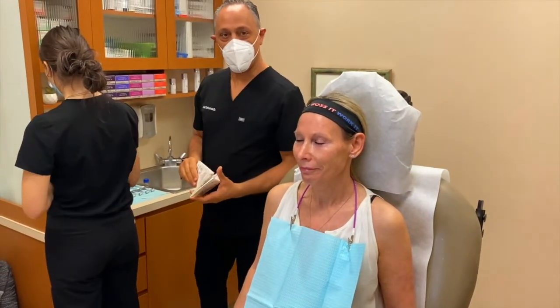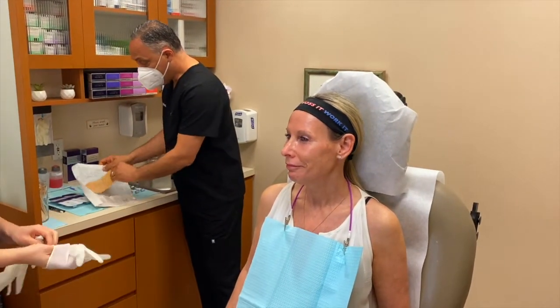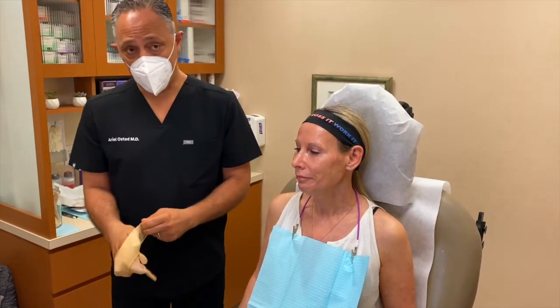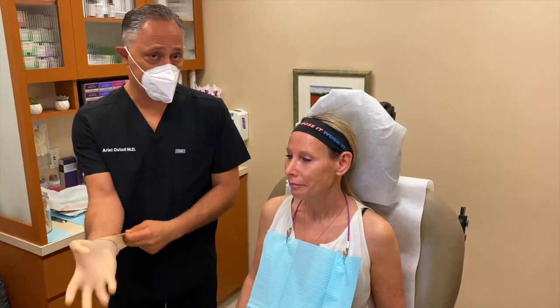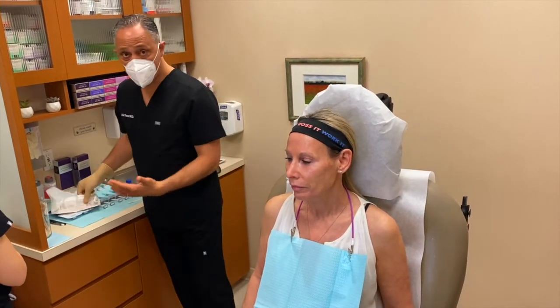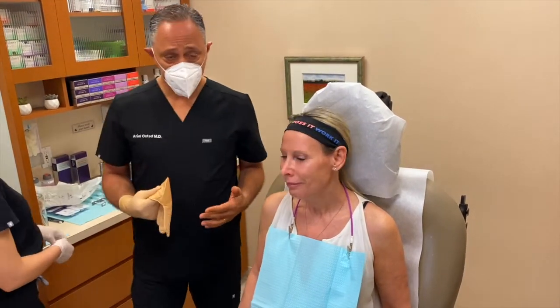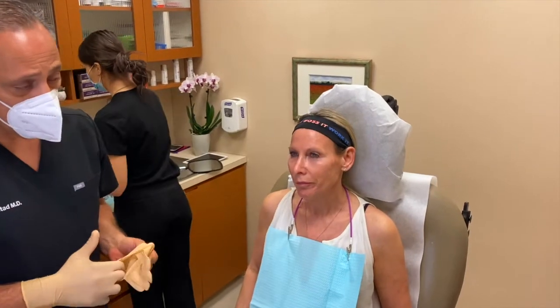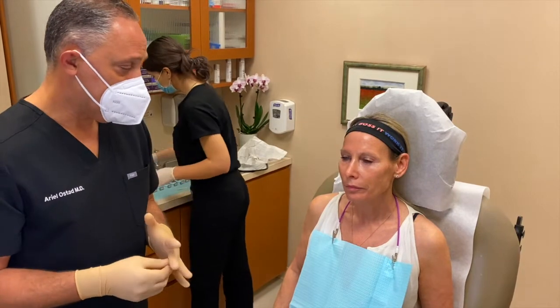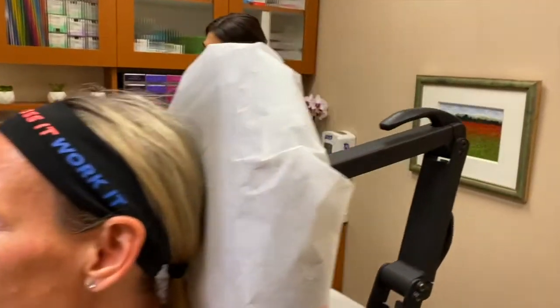One of the important things that I'm proud to say we follow is that we do this under sterile technique. To me, it's absolutely imperative that we do this in a manner where patient safety is foremost, so we want to avoid any complications. We use sterile gloves. We've already cleaned her face very carefully. You'll see my assistant, Kat, who's also following a sterile technique.